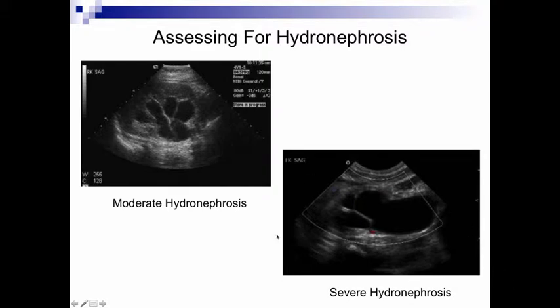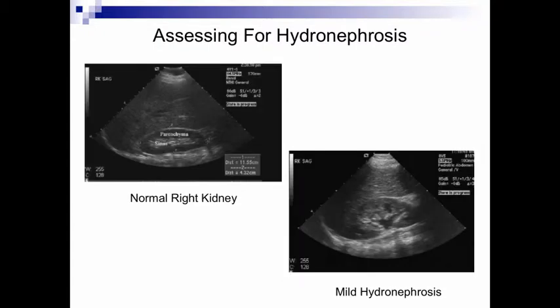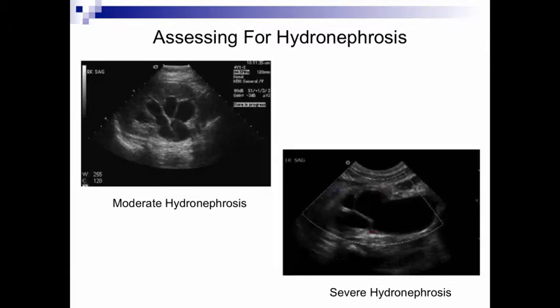One other big caveat is that although this is a relatively easy skill to acquire at a beginner level, the big pitfall is that it may be tough to call mild hydronephrosis, but moderate or severe are relatively easy to pick up. The caveat to keep in mind is that renal cysts can have a confusing echotexture that can look like this. The way to avoid being tripped up by renal cysts is to image the whole kidney, so superior to inferior pole, and fan all the way through.